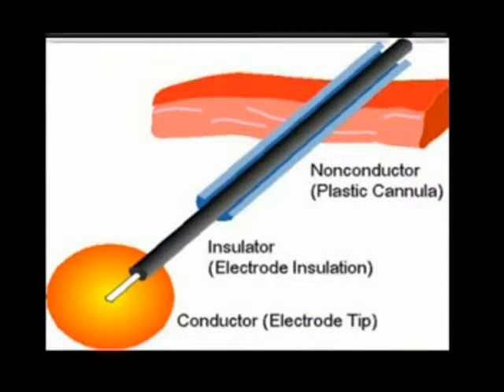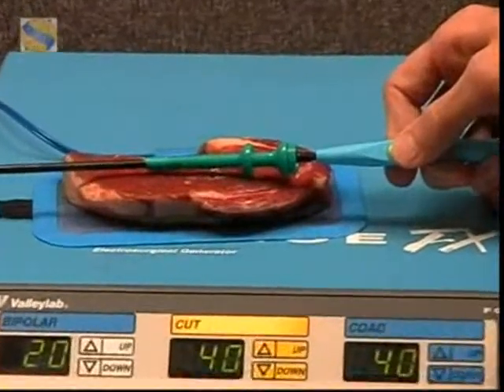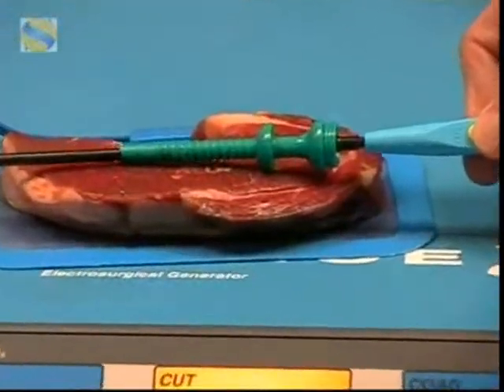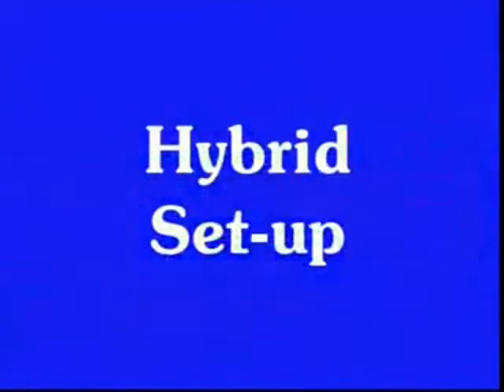If using a plastic port, capacitive coupling is not entirely eliminated since the patient's conductive tissue completes the definition of a capacitor. This combination is quite safe also. The worst combination, and the one you must be aware of, is what is termed the hybrid setup. You should never construct this system.